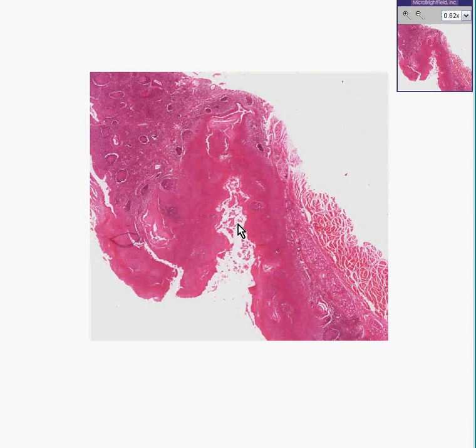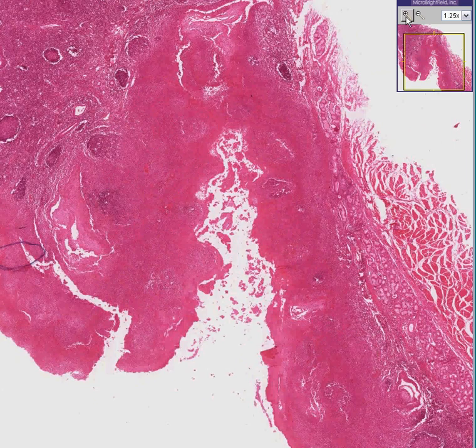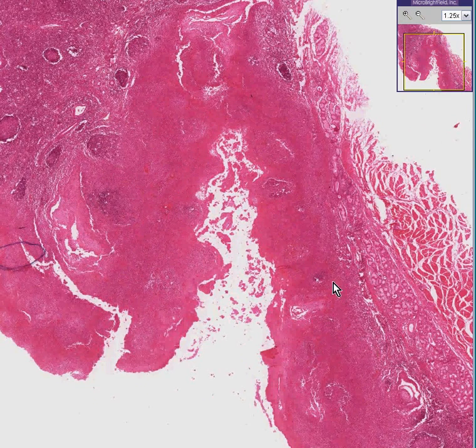Can you recognize what this is? Sure you can. Let's have some fun. I'm going to prove to you that you know exactly what this is.